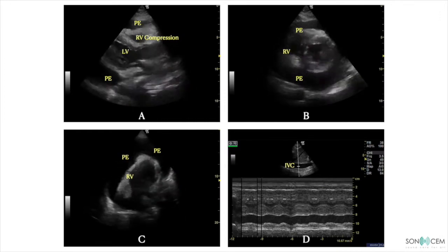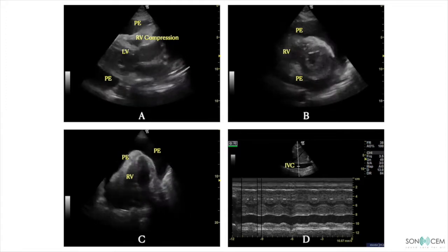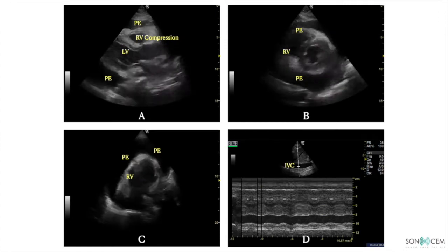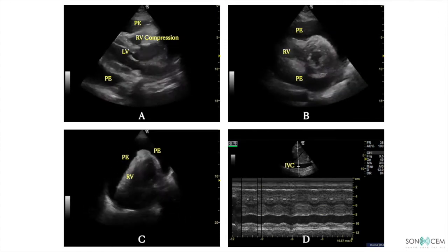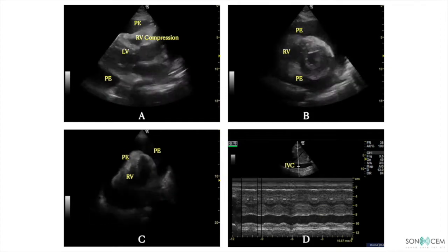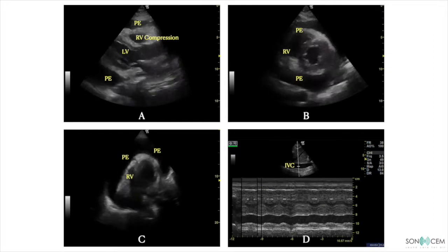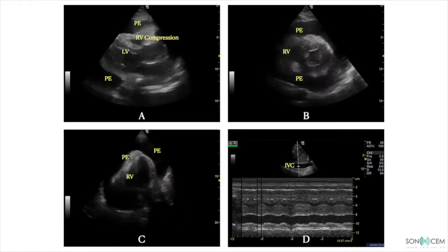Early diastole starts when the mitral valve opens. Clip B shows the heart is floating in the pericardial effusion. This is a parasternal short axis, and you can see the RV also being compressed here. Clip C is the apical four-chamber view, where you can see the right side of the heart hardly open up during diastole, hence compromising the venous return and subsequently reducing the stroke volume.